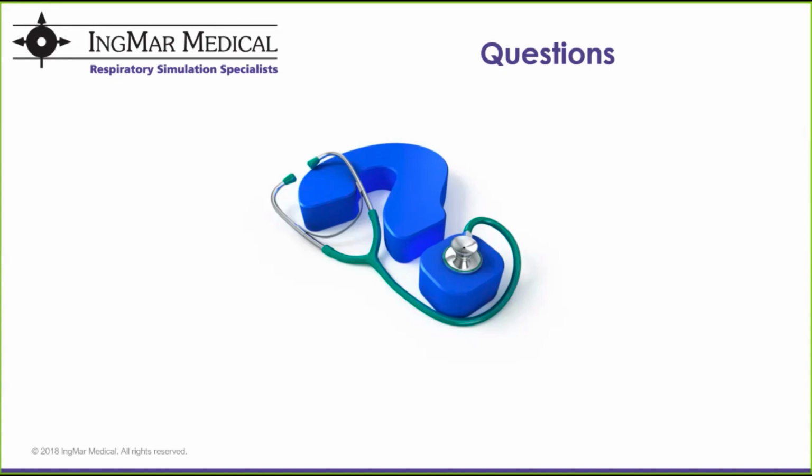There's a question here from Sam, and Sam asks, from a technician standpoint, would there be any maintenance, cleaning, etc.? So we do recommend, for the purpose of education, that the ASL 5000 is calibrated once every 2 years. So every couple of years, we would ask that you send the ASL 5000 to us here in Pittsburgh, Pennsylvania at IngMar Medical, and our calibration and service lab would be able to recalibrate the device to be sure that it is as accurate and repeatable as it's meant to be. But otherwise, there is no regular maintenance required.